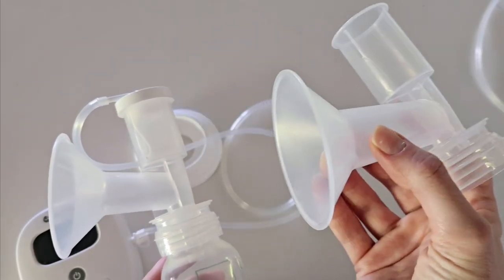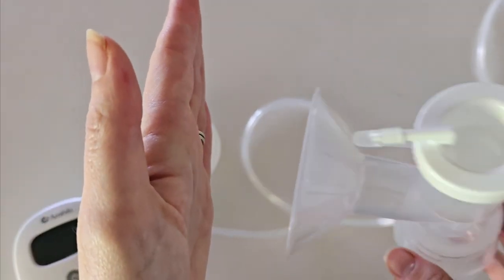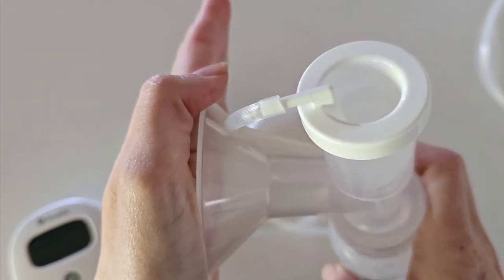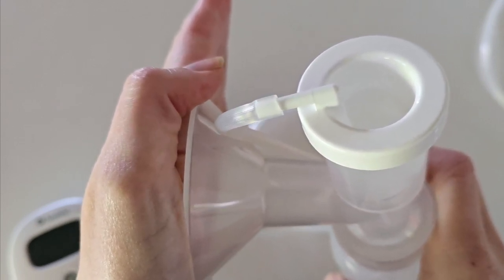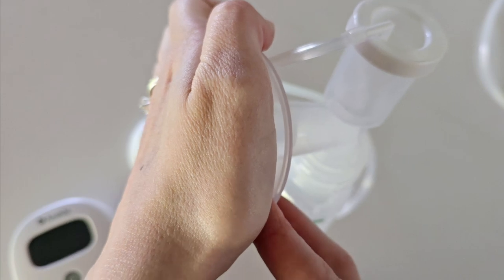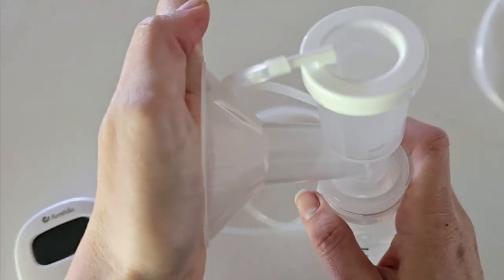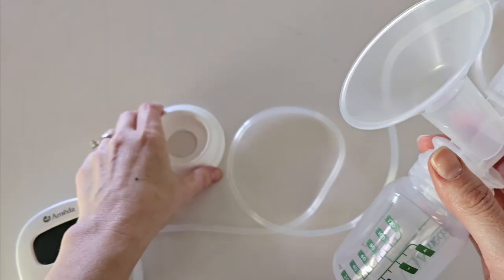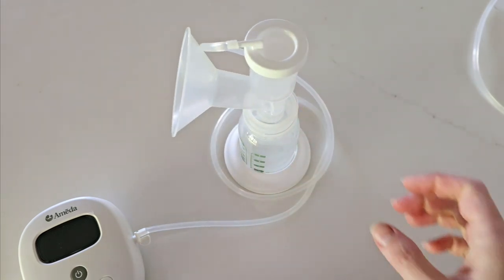Once you have the correct flange fit, align the flange on your breast with your nipple within the tunnel. Start your pumping session — go through stimulation mode until your letdown comes in, then switch to expression mode for around 15 to 20 minutes. When finished, lean forward slightly and break the seal by moving your finger in slightly. Don't just pull the pump off without breaking the seal as this will pull your nipple and be quite painful. Gently remove your pump and place it in your bottle stand.